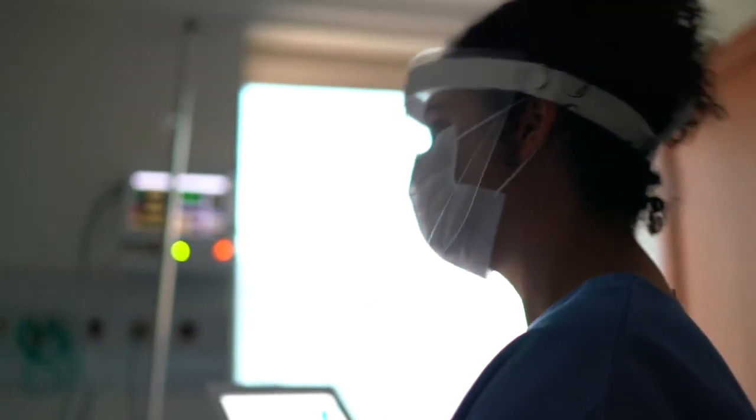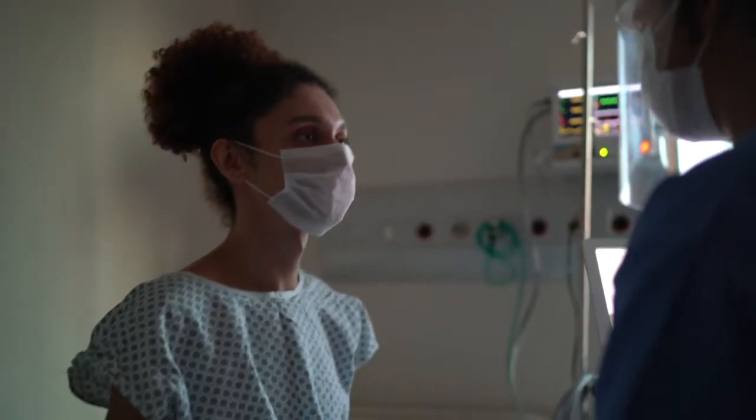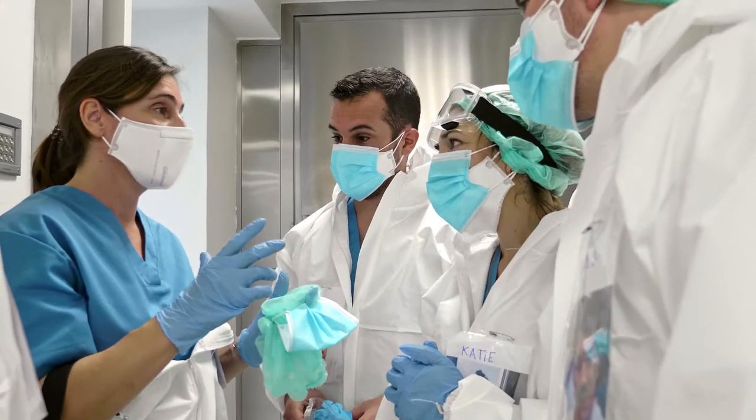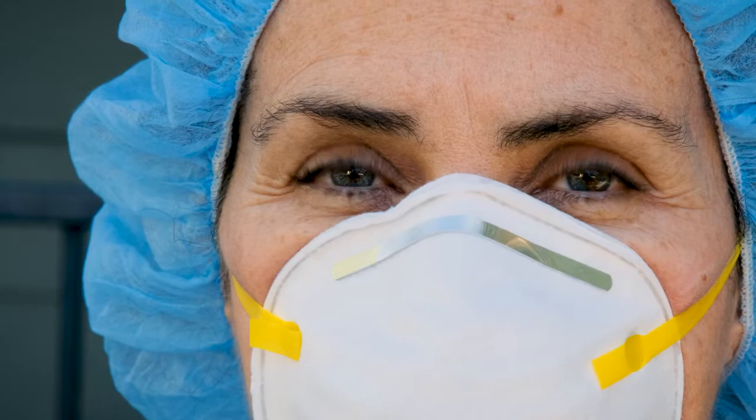We were impassioned to start this project to really help out now and in the future, because we want to ensure if this does ever occur again that our medical professionals, the people that are the hardest hit by this pandemic, are protected and are safe.